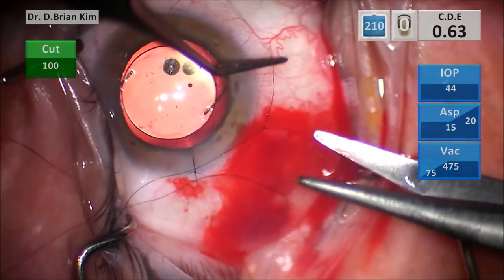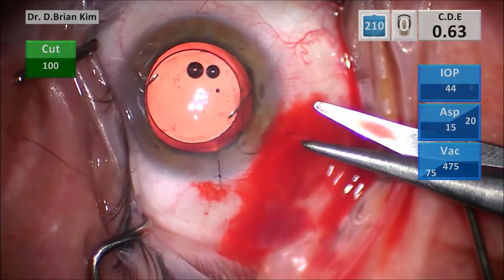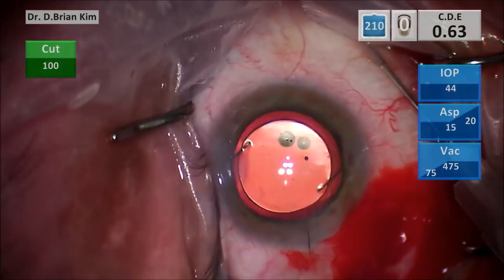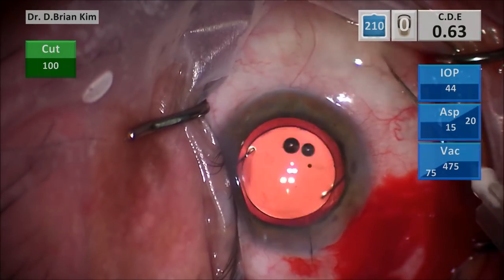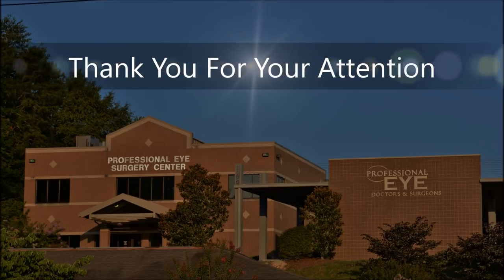So then after closing all the incisions, close conjunctiva, the sclerotomy, and the temporal main incision, bury all the knots. And with any vitrectomy case, I always like to end with a subconjunctival Ancef. I'm hoping you learned something new, and thank you for your attention.